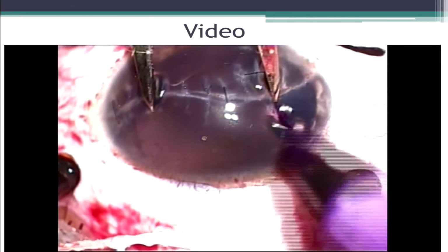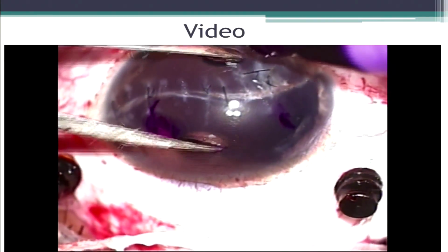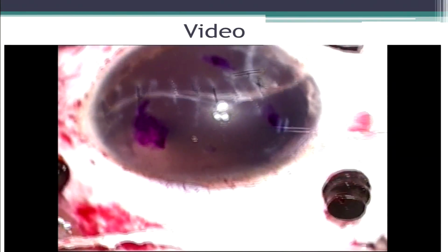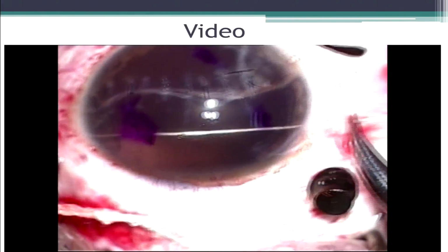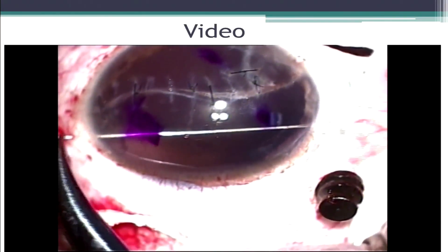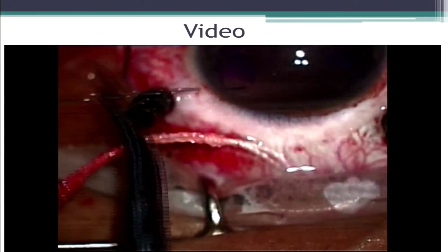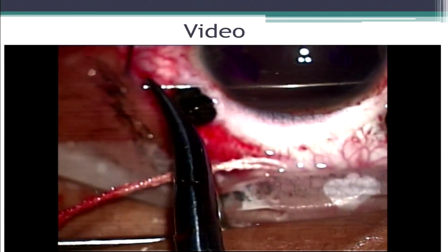You can see there is a traumatic aniridia. We have done a pars plana base dissection. We are doing an internal drainage by creating an internal retinotomy. A 5.5mm zone is created, and then a 10-0 Prolene suture on an STC6 needle is passed 1mm behind the limbus and taken out from the opposite side 1mm behind the limbus. This needle is then reversed back, and again a grid is created.